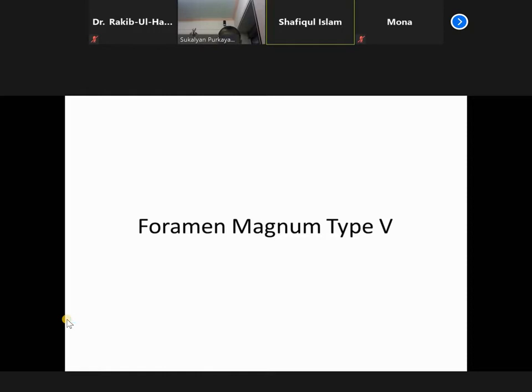So grade 1, first you have to see the patient nicely. See the patient means you have to work up the patient with an MR scan, CT, I don't like MR scan, along with the DSA. So these are the two things which are a must. In DSA, you see what arteries are involved, and if there is any propensity to shift to the higher grade or not.